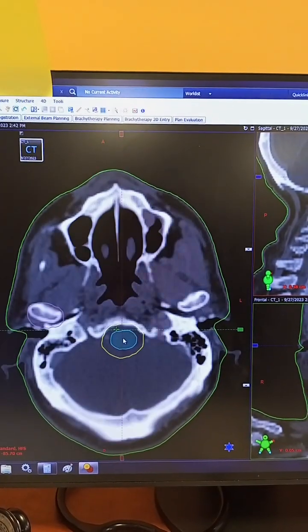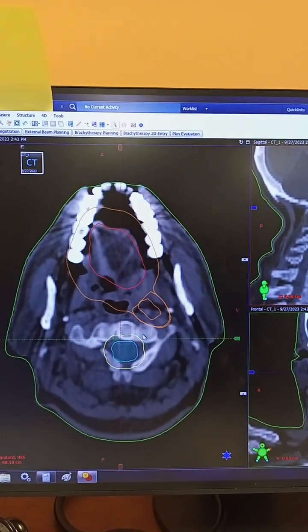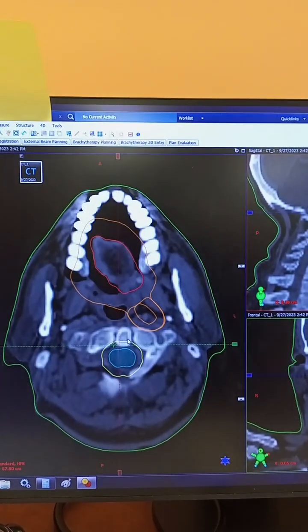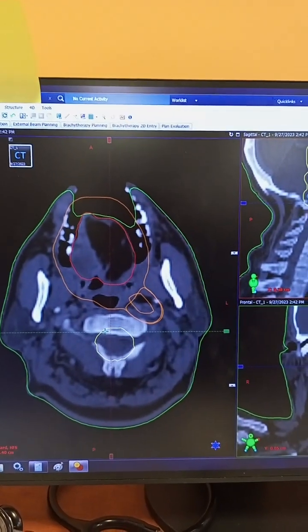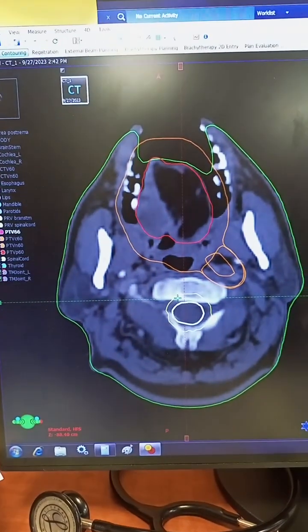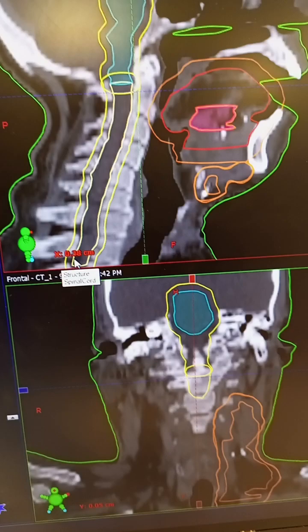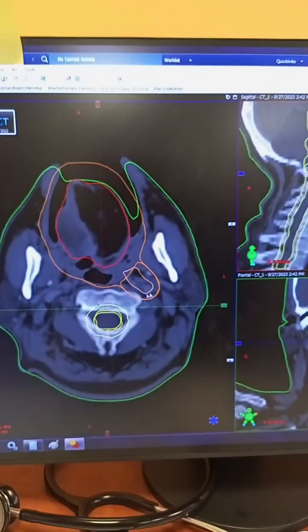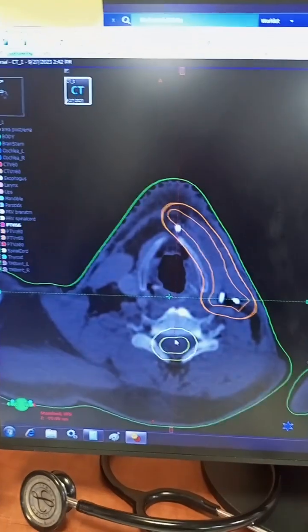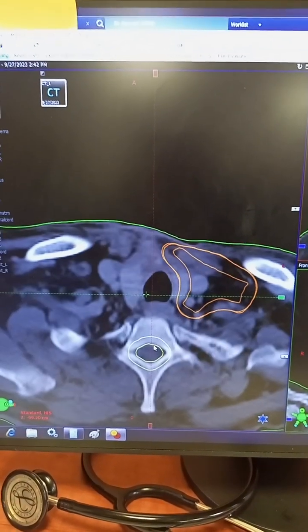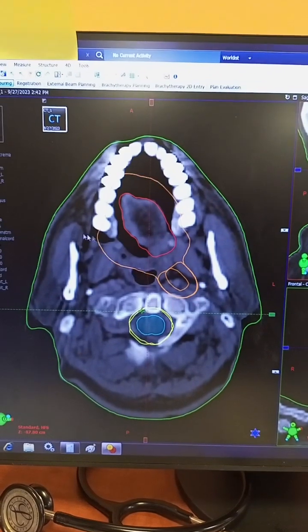The brainstem extends into the spinal cord at the first cervical vertebra — the odontoid process of the atlas and axis. After that we have drawn the spinal cord and its spinal cord PRV. The yellow structure below is the spinal cord and its PRV. We can see the spinal cord running along with its PRV.